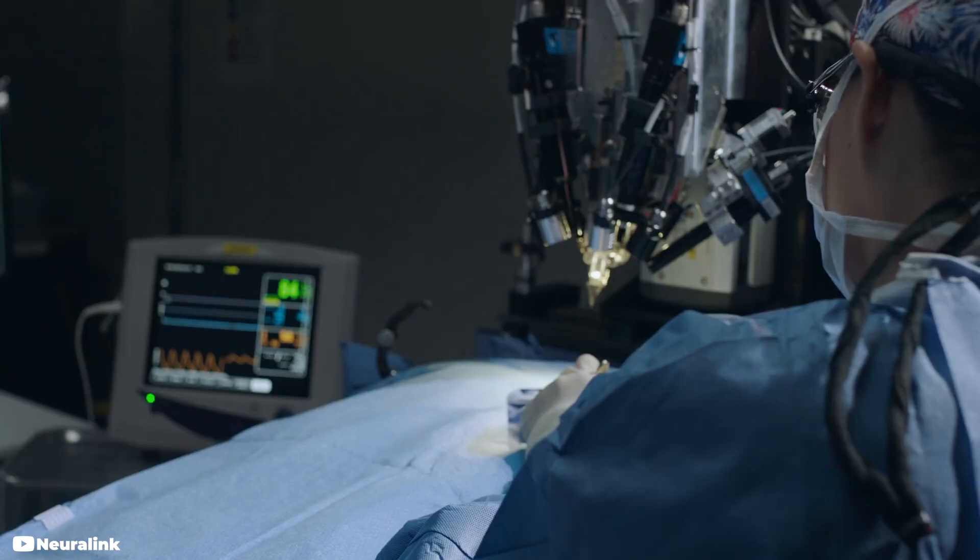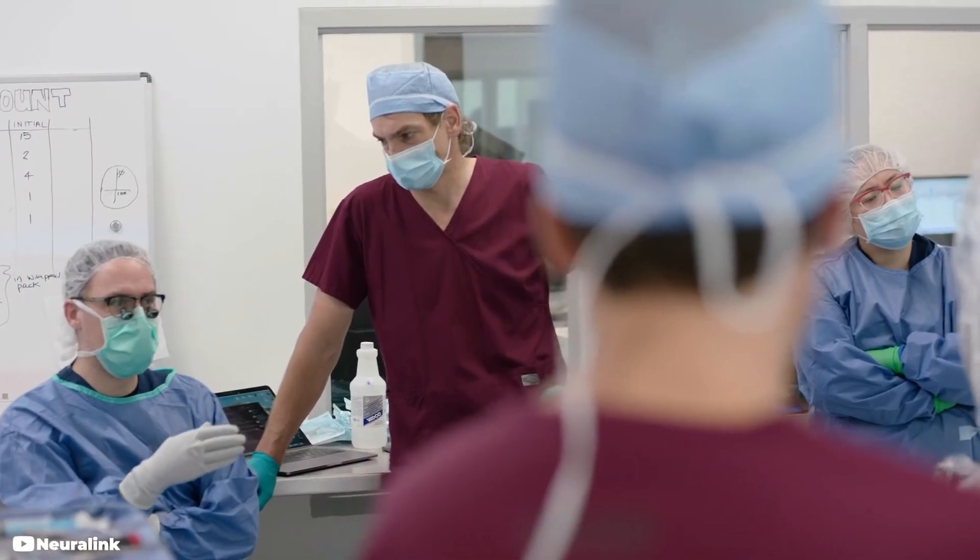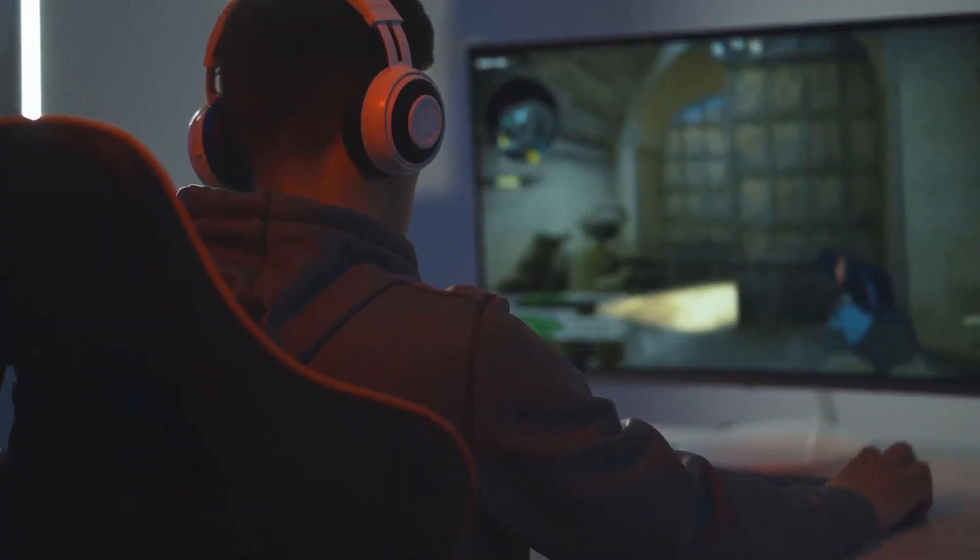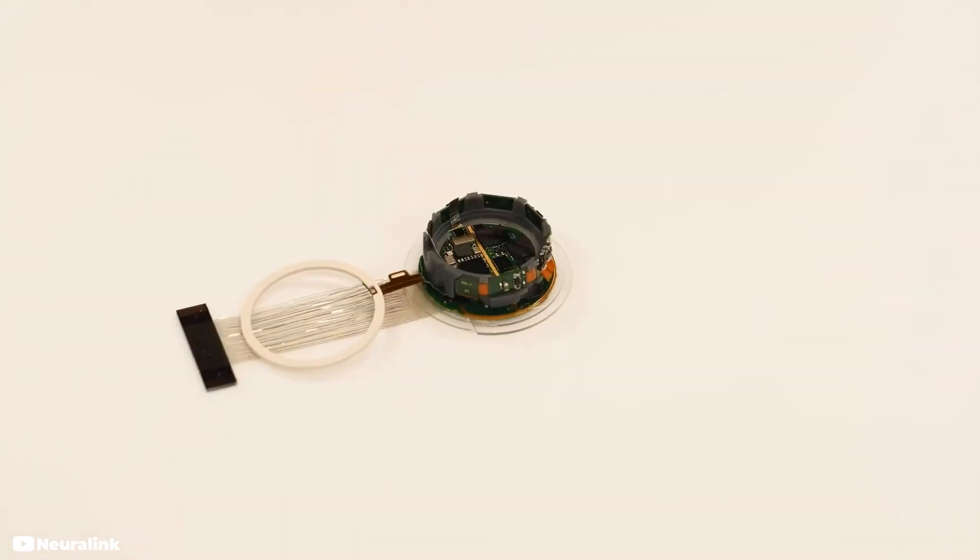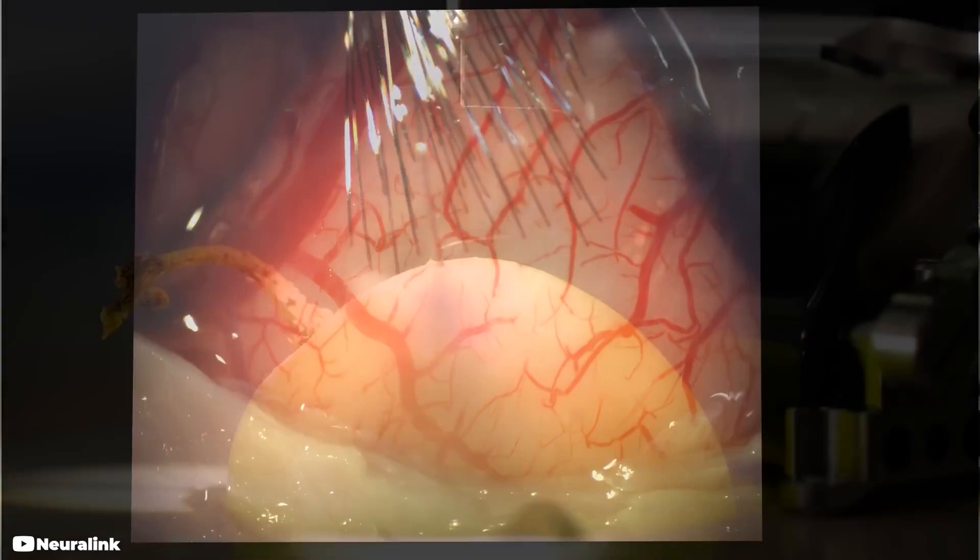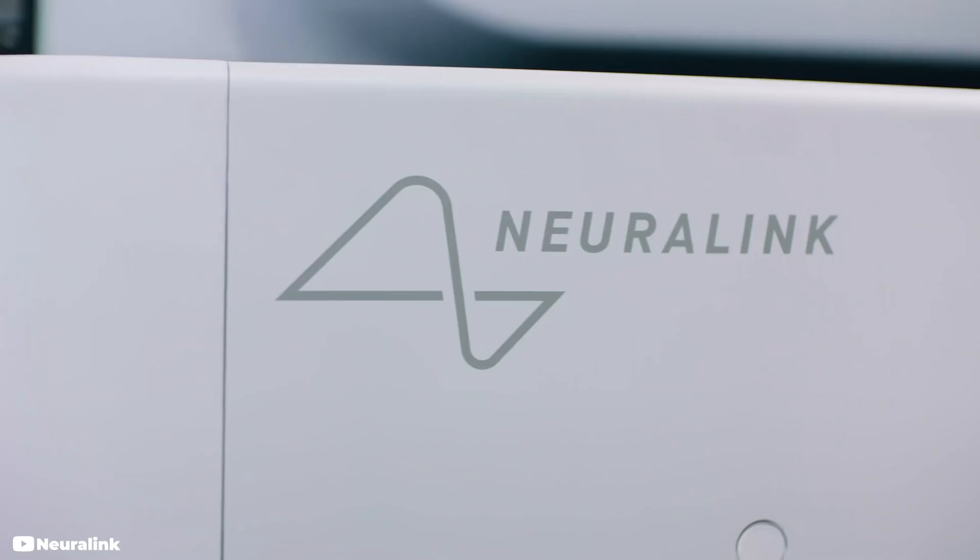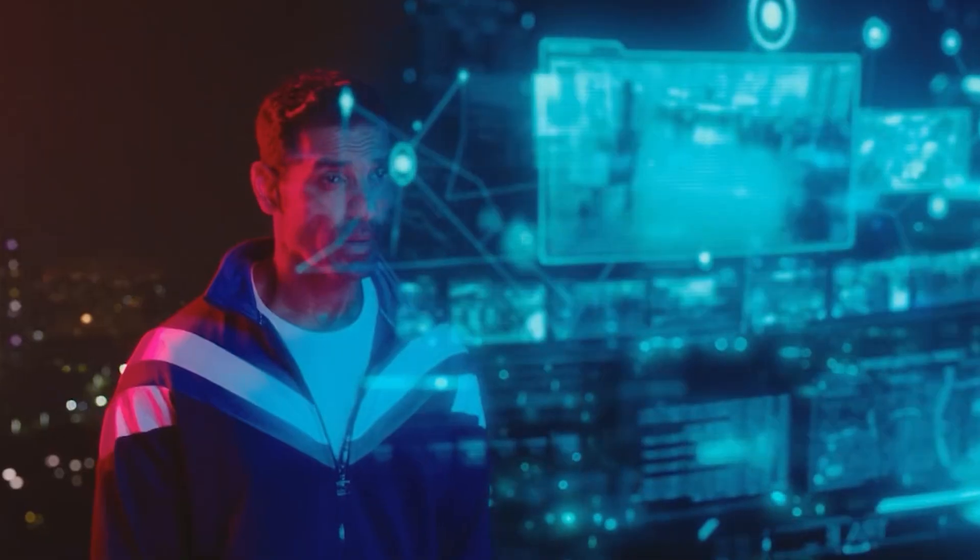For example, an implant that is used to treat a medical condition, such as paralysis, may be covered by insurance, while an implant that is used for non-medical purposes, such as gaming or entertainment, may not be. Overall, the cost of Neuralink is likely to be a significant factor in its adoption. However, as the technology matures and the costs come down, it is possible that Neuralink could become a more affordable and accessible option for people who could benefit from it.